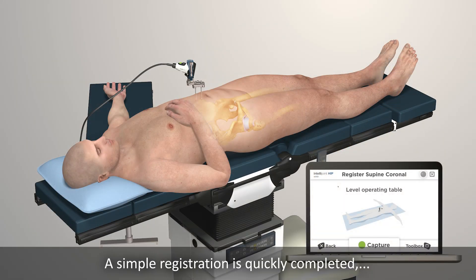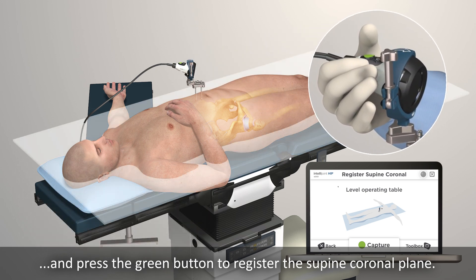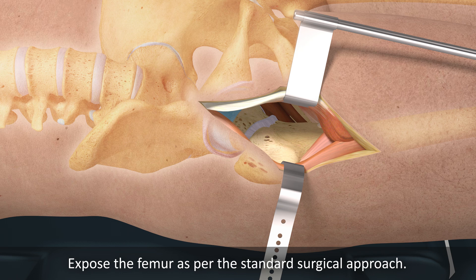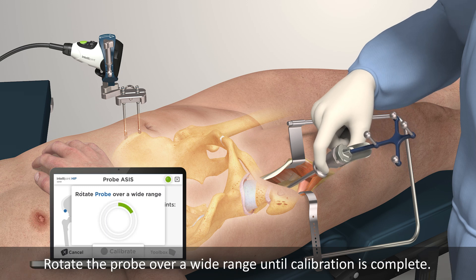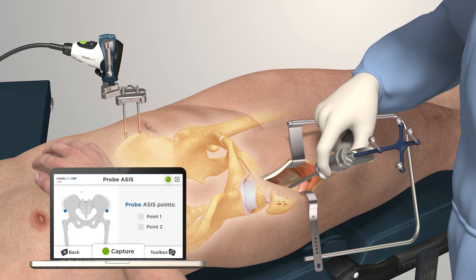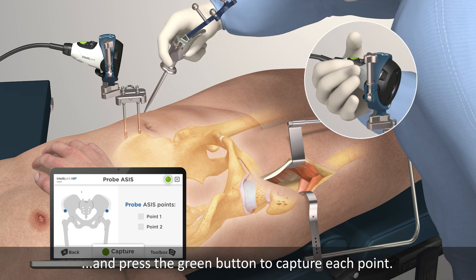A simple registration is quickly completed following accurate positioning of the patient. Ensure the operating table is level and press the green button to register the supine coronal plane. Expose the femur as per the standard surgical approach. Install the femoral disc on the anterior aspect of the greater trochanter. Attach the tracker to the probe and place the probe tip on a stable point. Rotate the probe over a wide range until calibration is complete. Probe both ASIS points to define the inter-ASIS line by placing the probe and tracker on a point over the patient's skin and press the green button to capture each point.